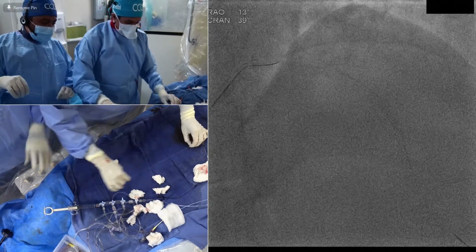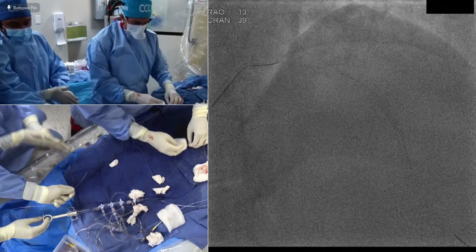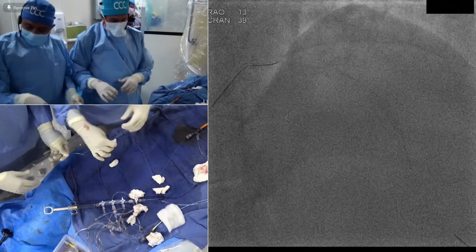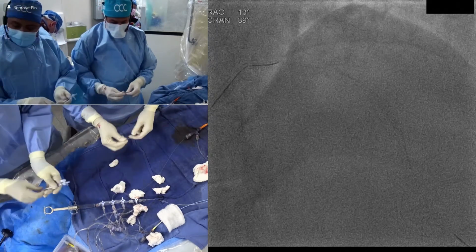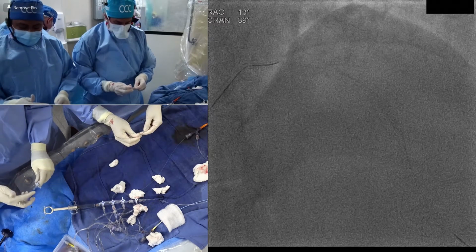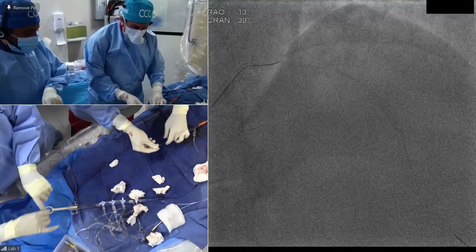Let's see. We keep making this case even more complicated every time. It's really a great case. Really a great case. Any other techniques?